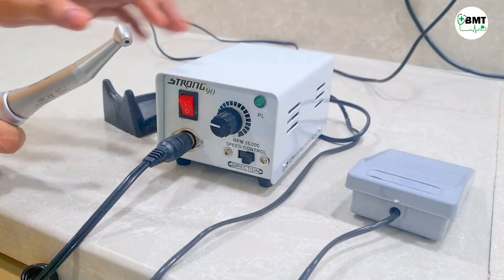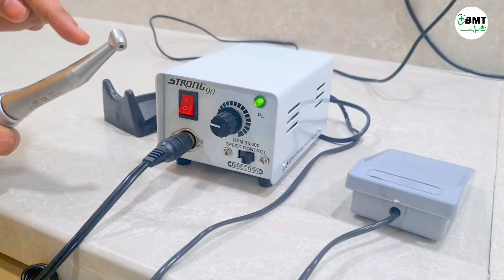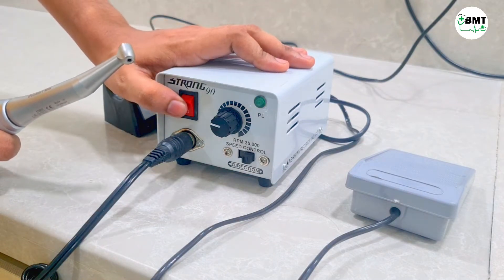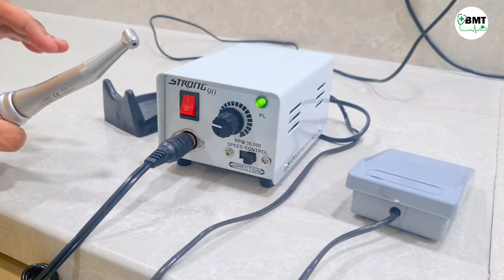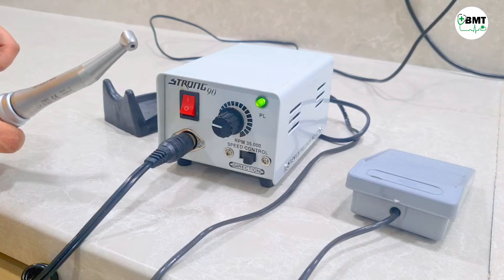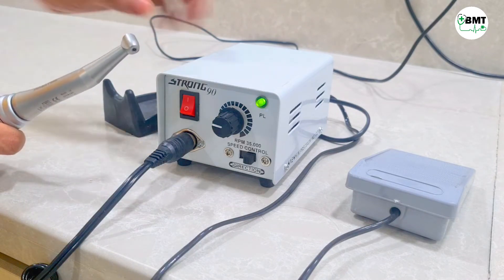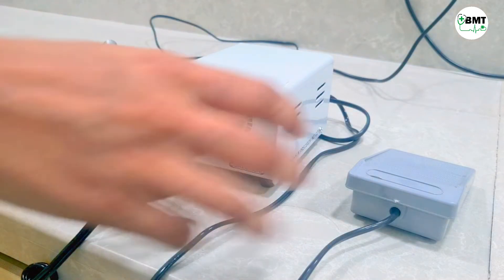In continuous mode, drilling starts continuously. The continuous mode is turned on by this button. In this mode, the motor is continuously on and continuously working. Here you can connect the drill bit. To turn it off, press the button again.